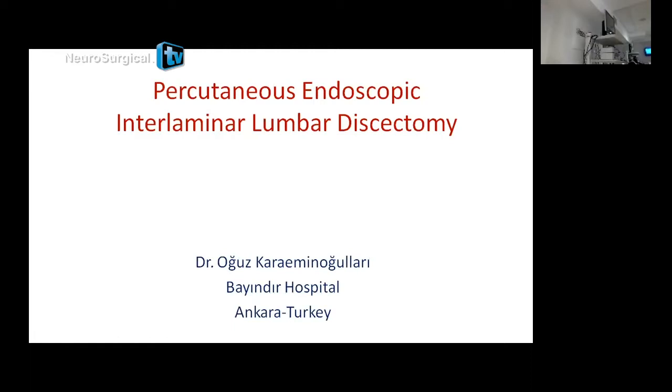So in the video, we saw the same: the PLL, the epidural space, and the disc space. Yes, that's true. But you can have this vision only when you enter. Just enter, just if you are here, at the beginning of the PLL.